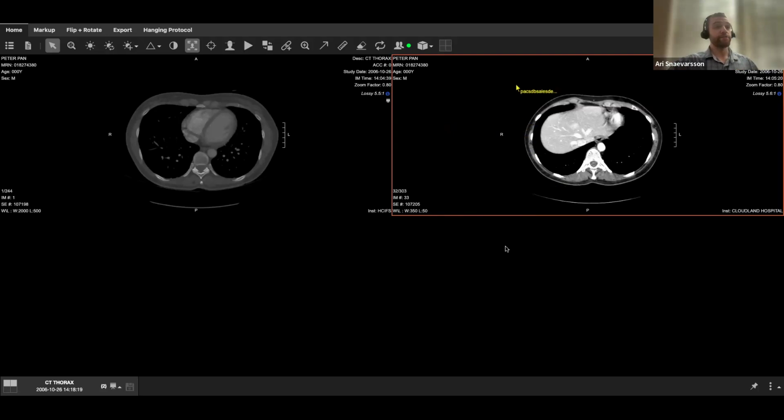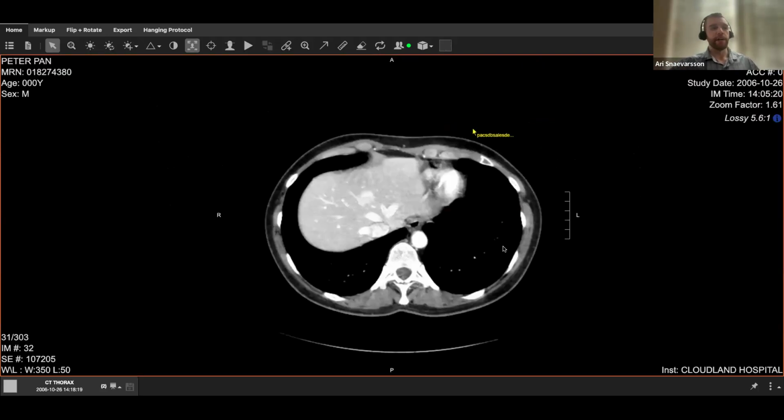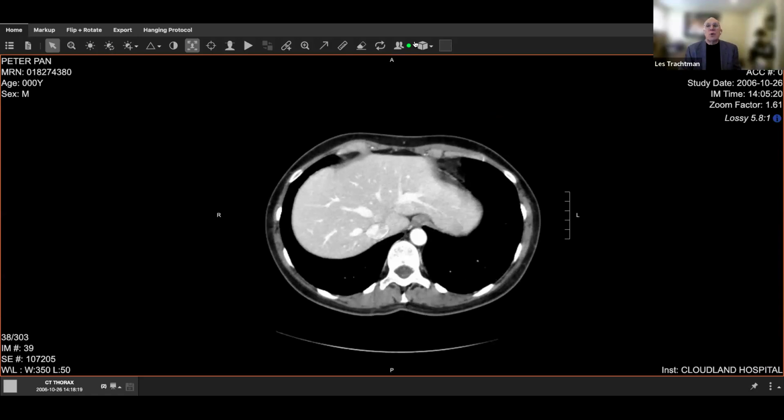That's exactly right. And so now Les might be reviewing the image. He might be showing me some of the complexities associated with an injury, an anomaly, disease progression, and so forth. And so that's just one way that we're able to review this together. That's me making those changes, just in case you were worried, Ari. That's right. So I may sign out of this here.